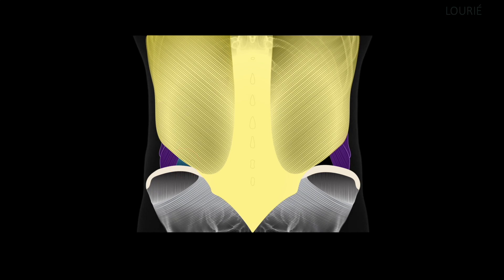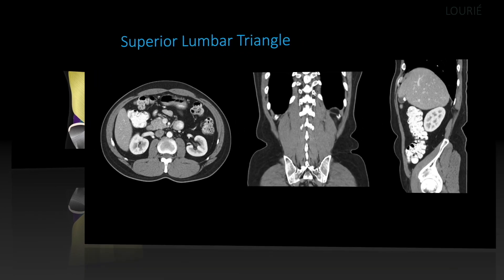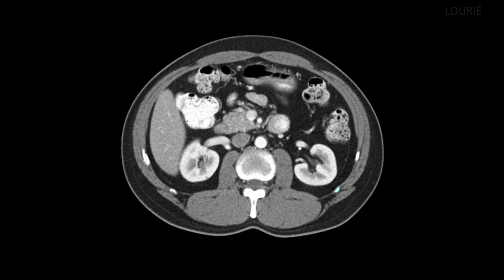To fully recognize the pathology of lumbar hernias on a CAT scan, we must first recognize normal cross-sectional anatomy of both lumbar triangles. In this axial scan, we see posterior to the kidney on the left side in blue the tip of the 12th rib. The quadratus lumborum is in red as another border of the triangle, and the latissimus dorsi in yellow forms the roof. The floor of the superior lumbar triangle is formed by the very thin aponeurosis of the transversus abdominis. Additionally, the thin lateral conal fascia extends beyond the greater curvature of the left kidney, attaching to Gerota's fascia.